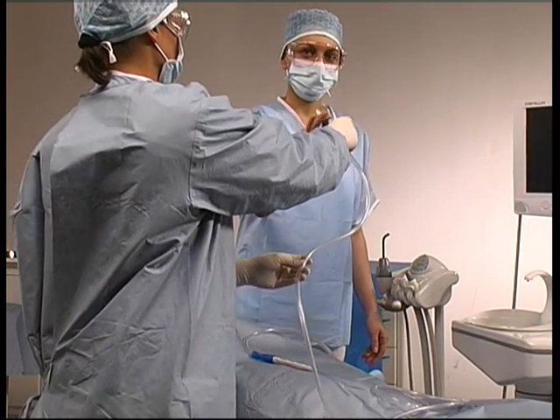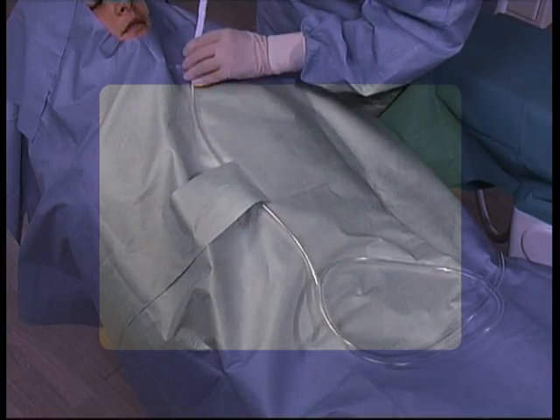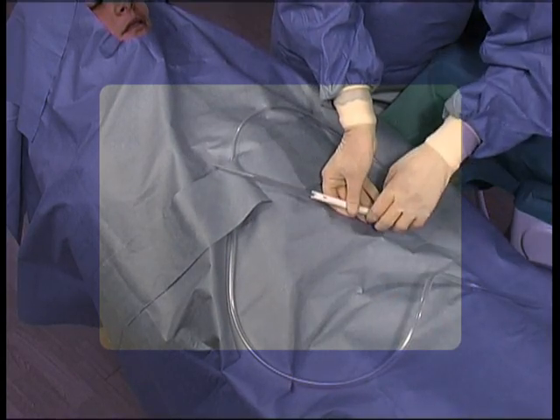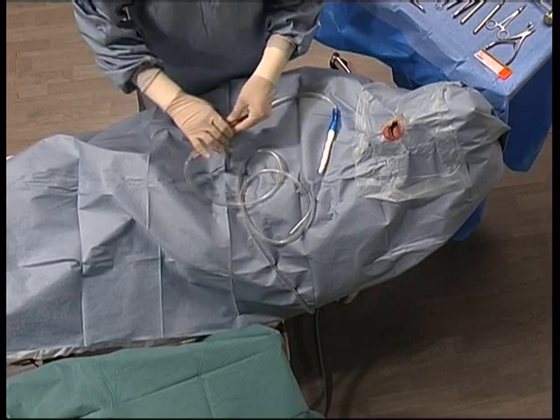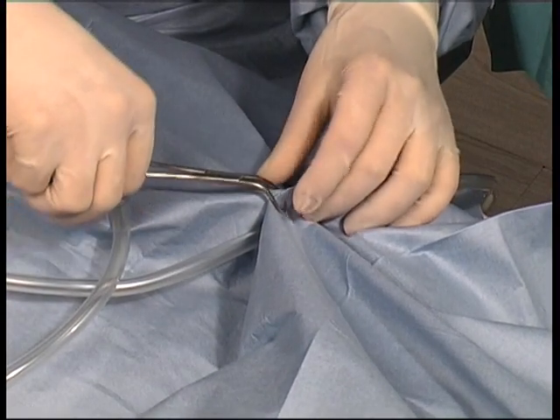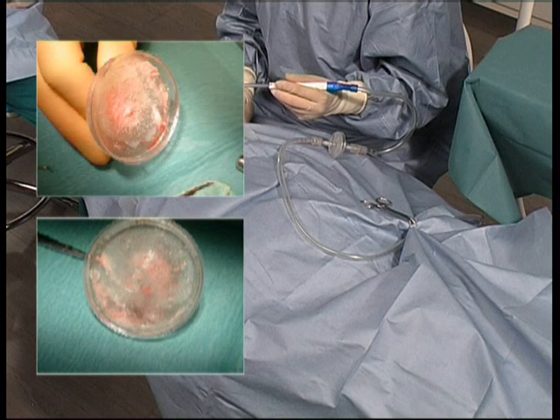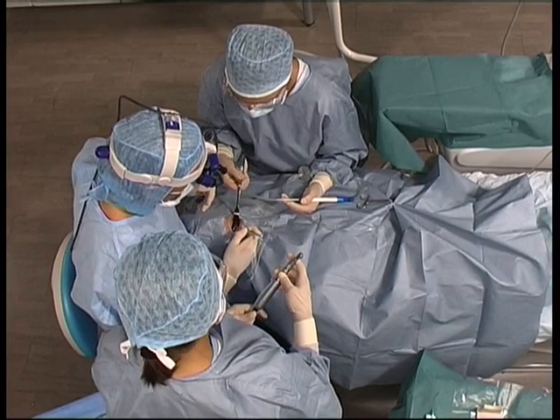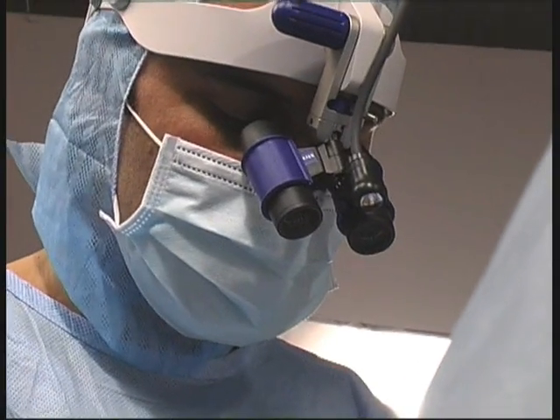Once the patient is completely prepared, the disposable suction system is connected. The slotted drapes stop the cannula from being accidentally dropped and consequently contaminated. If required, autologous bone collection filters can be applied to suction systems that have special Luer fittings. At this point, the environment has been correctly isolated, and the team can now move on to the surgical phase.